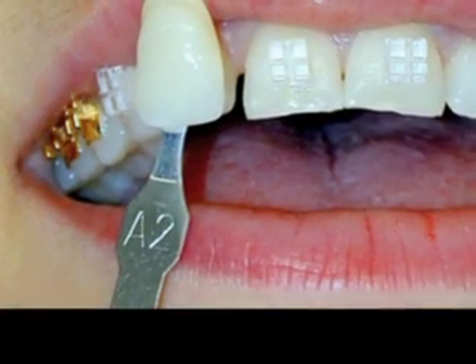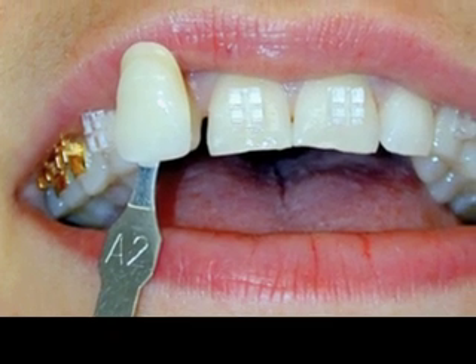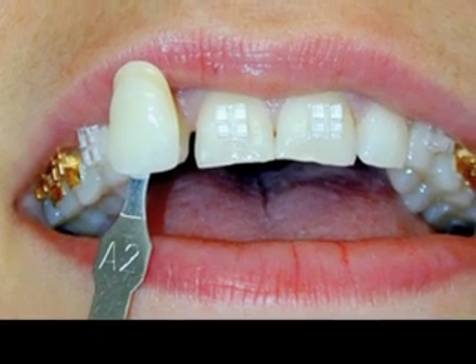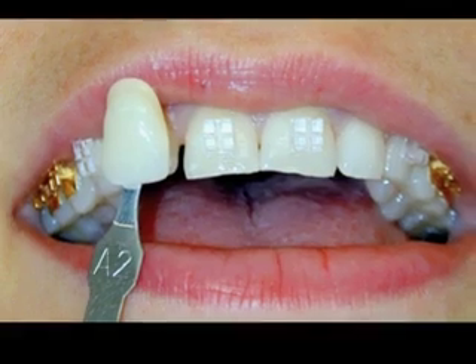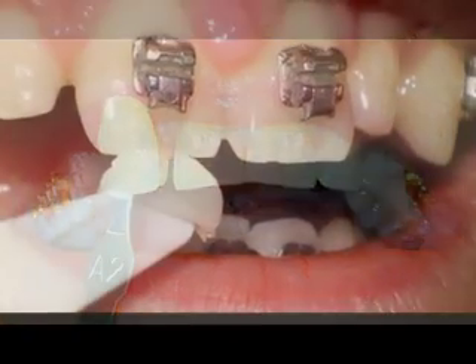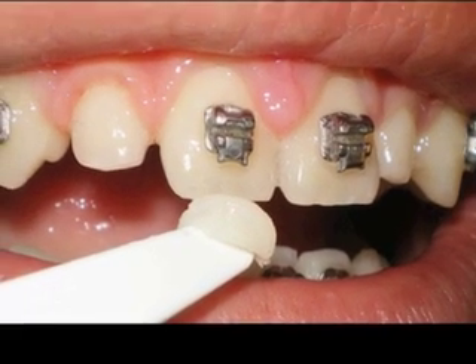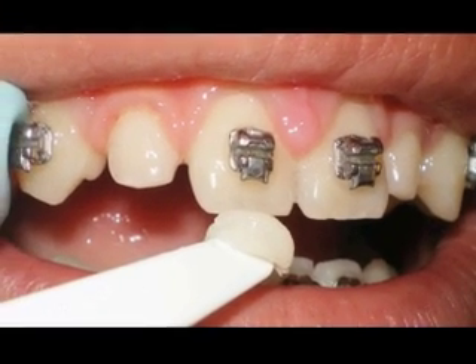After we've properly trimmed the face-o-form — and that's really important — we'll determine the composite color we'd like. You can use a standard color guide, but I like to hold a small dollop of the selected composite up against the centrals to verify color. Of course, most teeth have an average color, so I start my selection process there.